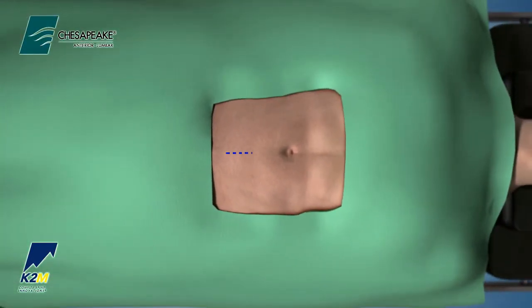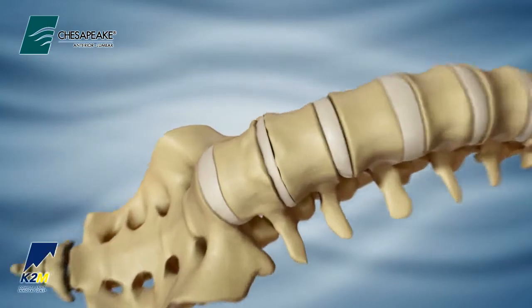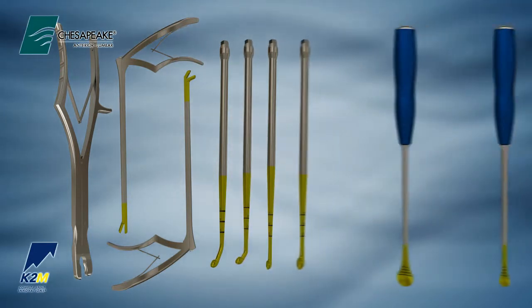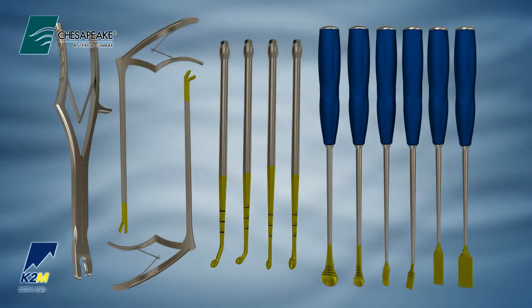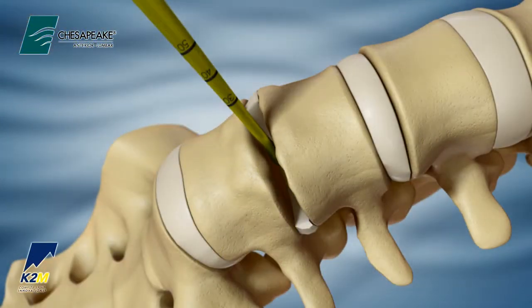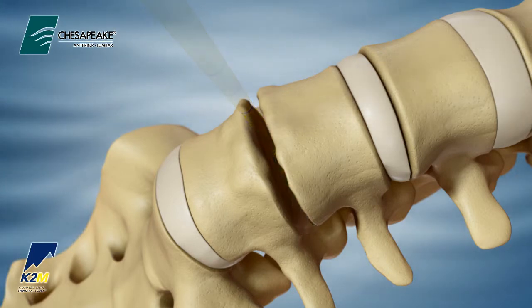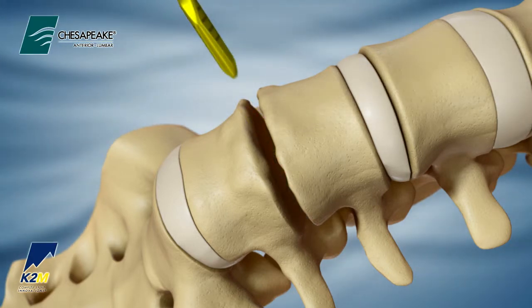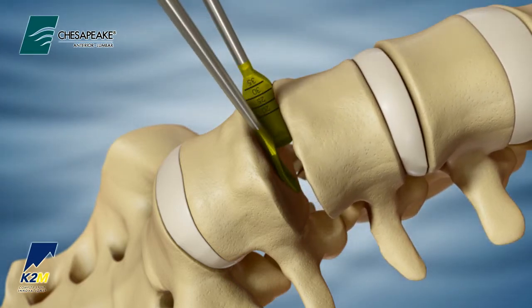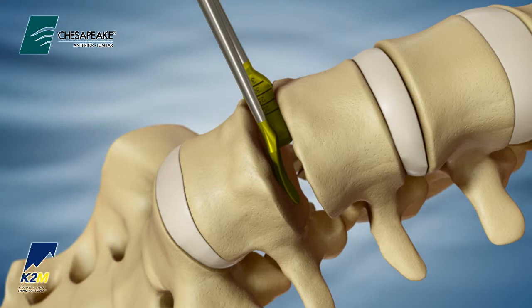The Chesapeake Anterior Lumbar Set is designed to facilitate a direct anterior surgical approach. A selection of disc preparation instruments are available in the K2M Anterior Lumbar Preparation Instrument Set to perform a complete discectomy. Disc removal and initial preparation of the end plates may be achieved by using various forward and angled cup-style curettes. A variety of ronguers, rasps, osteotomes, and cobs are also available to help repair and decorticate the vertebral end plates before inserting the interbody. Adequate preparation of the end plates is important to promote vascular supply to the implant.